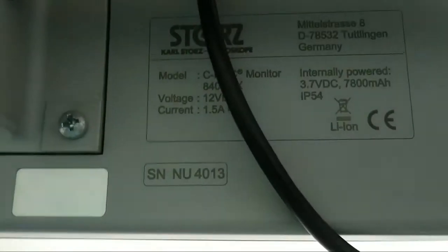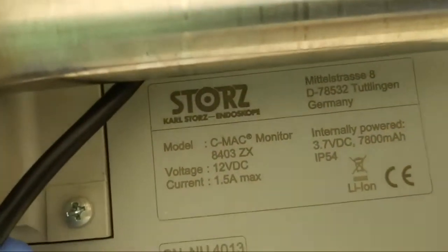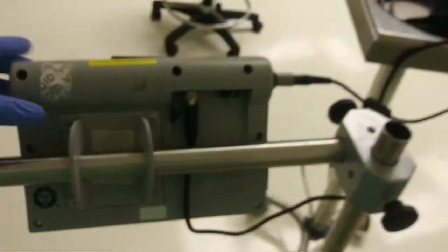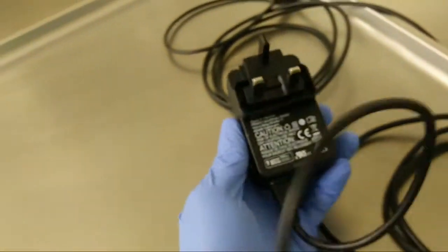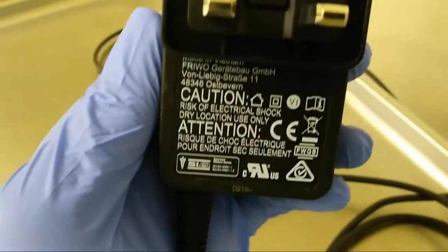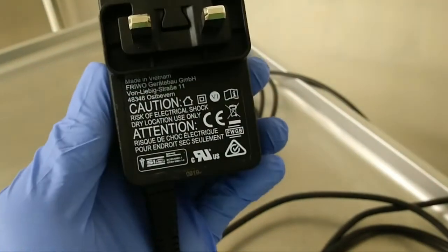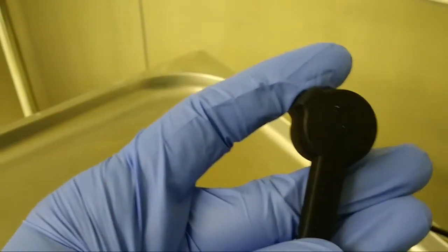Its voltage is 12 volt DC and 1.5 ampere maximum. An outside electrical power source is needed. The manufacturing company offers a 2-hour battery backup. I promise you, using this equipment I easily get 1.5 hours. Battery backup varies with video and photo capture and data sharing, depending on usage.